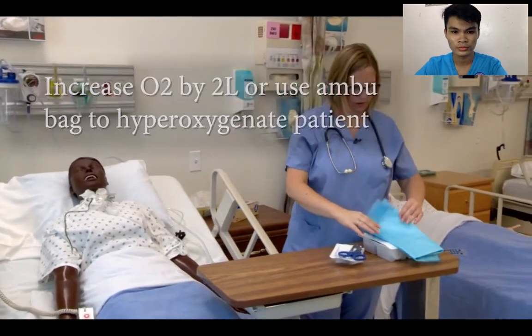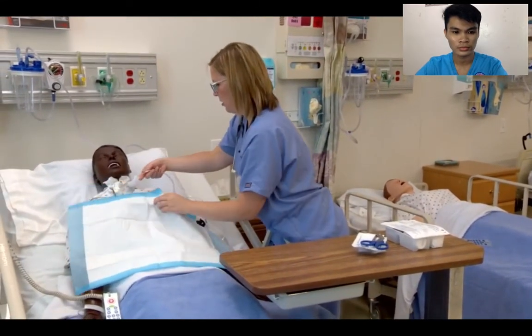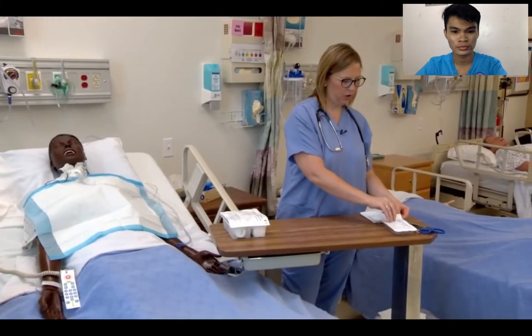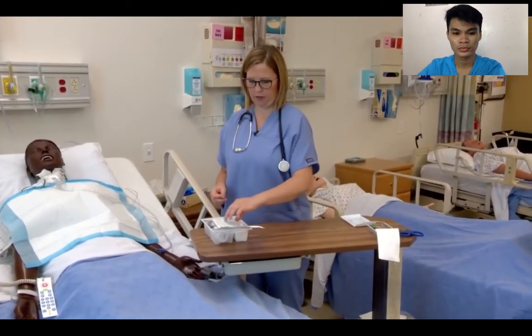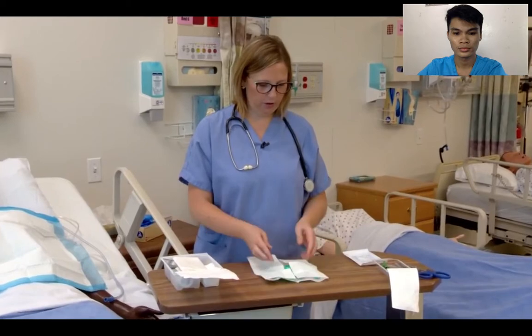Okay, now I'm going to set up my field. I'm going to take the drape and place it over Mr. Jones's chest. Put this across you, Mr. Jones, so we don't make a mess. Okay, and now I'm going to prepare my field. We want to open up the suction catheter. And now we're going to open up our trach care kit. And remember, everything inside the trach care kit is sterile. Apply my sterile gloves.